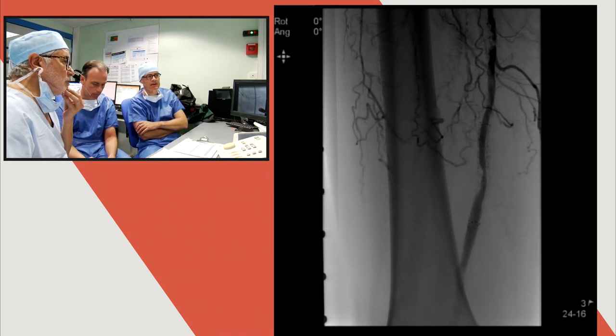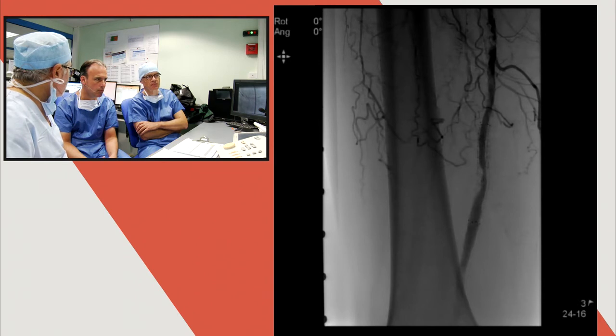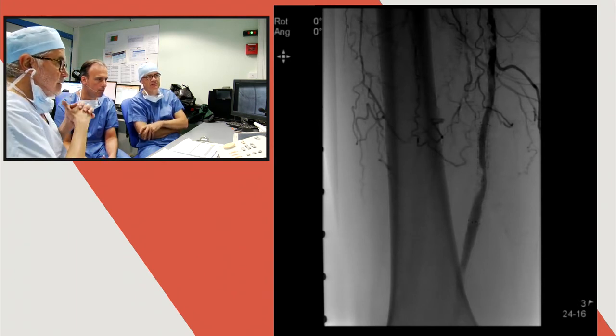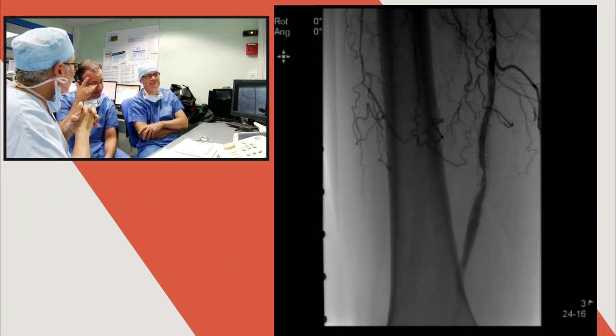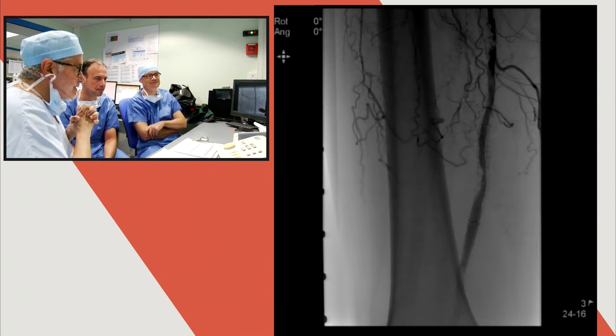As you said before, it was a balloon expandable stent that was placed several years ago, and it seems to be a little bit under-expanded. Exactly. It was 20 years ago. We were under-expanding. We have been more careful since.